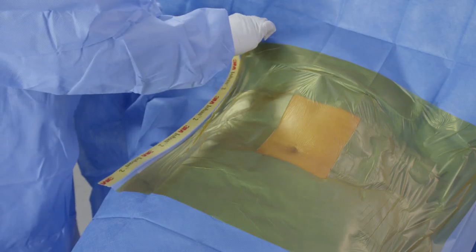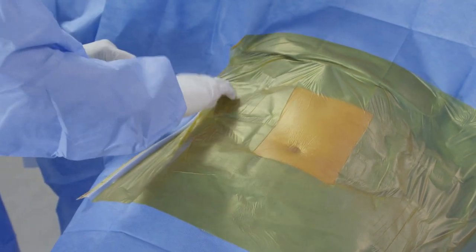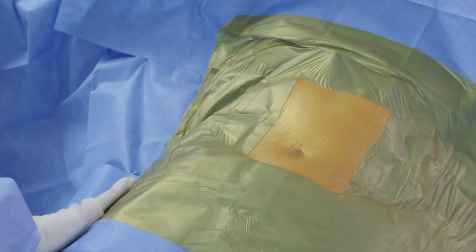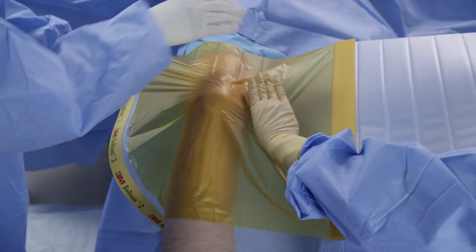Once the drape has been applied, you may remove the rest of the liner and the printed handle by placing a thumb on any quarter of the Ioban drape film and peeling the liner back or tearing the printed handle off. When applying the drape on a knee, bend the knee 30 degrees, then apply the drape.